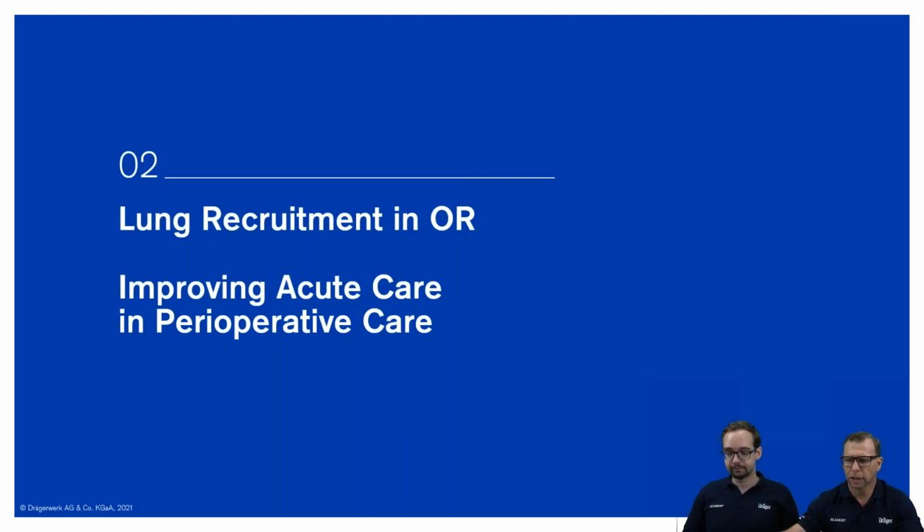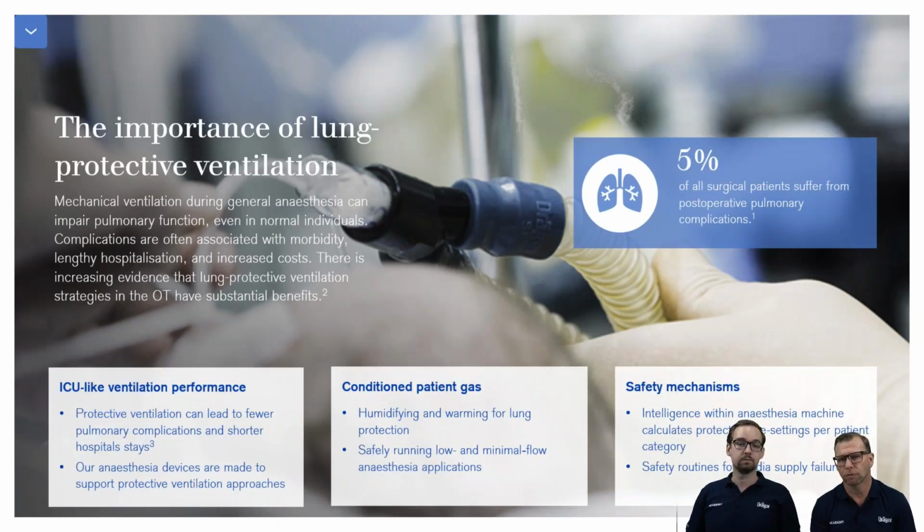Excellent. Thank you, Christian. That's the core of what we're also trying to achieve when it comes to lung recruitment in the OR. A lot of the atelectasis that you encounter in the OR will obviously be very recently introduced, which gives us a significant advantage.